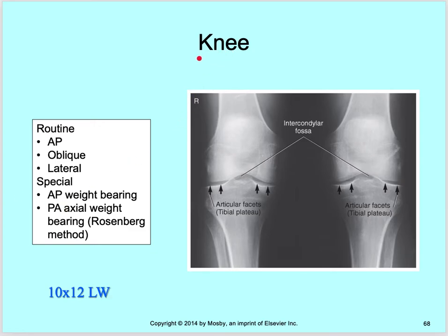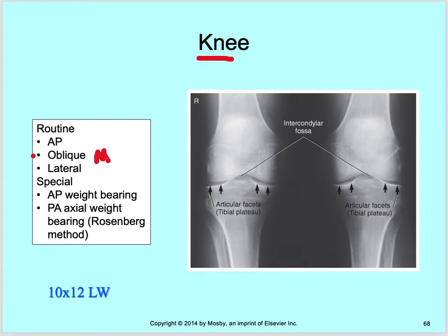Alright, so the knee. Our routine is an AP, an oblique, and a lateral. We have special weight bearing and then PA axial weight bearing, the Rosenberg method. Keep in mind that your oblique can also be, most of the time, a medial oblique, but you can also do a lateral oblique depending on the location that you're at. It could be part of their routine.